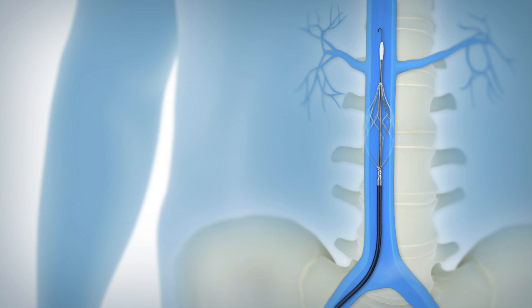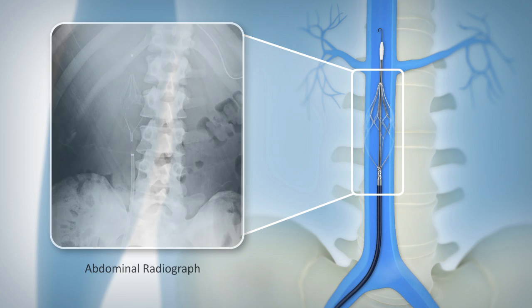Following placement of the Angel Catheter, it is recommended to confirm proper position of the filter via an abdominal radiograph, KUB.